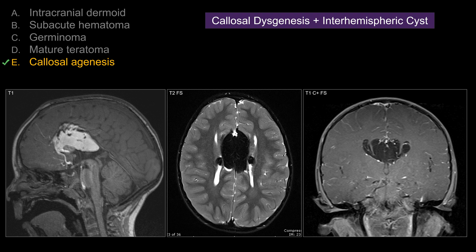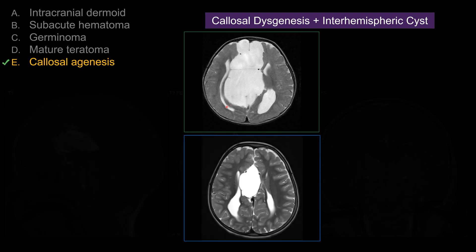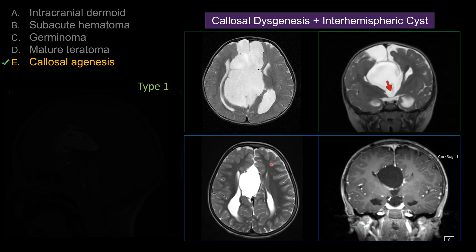For interhemispheric fissure cysts, here are two examples. Both show parallel appearance of the lateral ventricles as well as dilatation of the atrium and occipital horn — so colpocephaly. There are two types of interhemispheric cysts, type 1 and type 2. Type 1 refers to when the cyst is communicating with the third ventricle — essentially a diverticulum of the third ventricle. Type 2 is when you do not see communication between the cyst and the ventricular system.